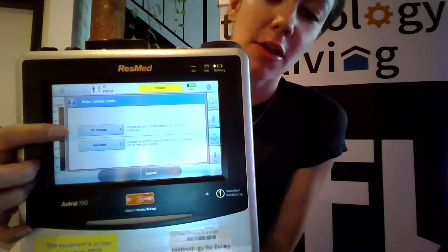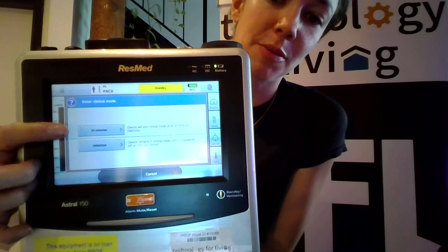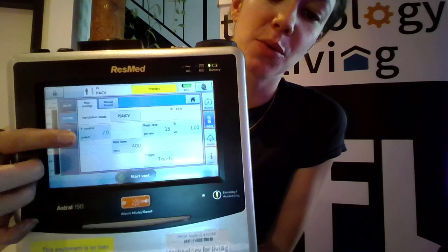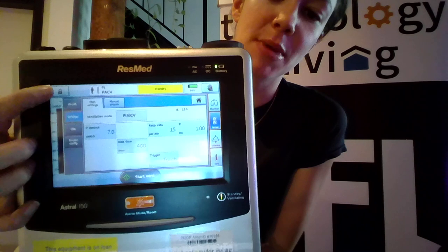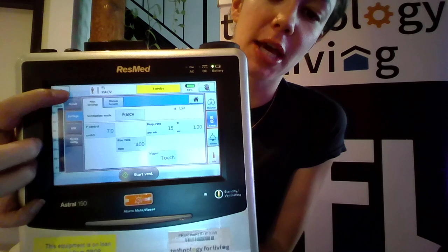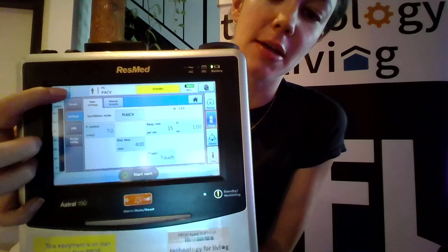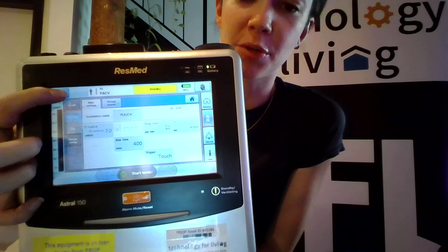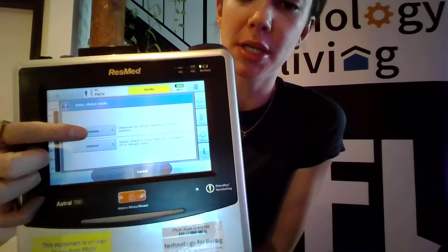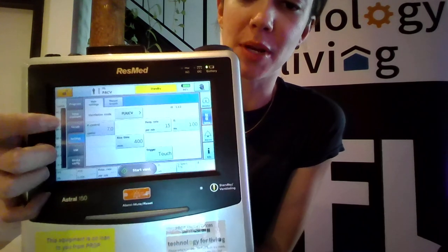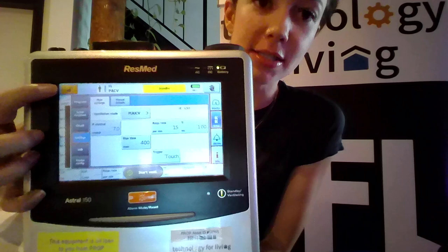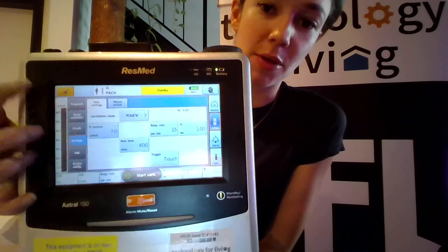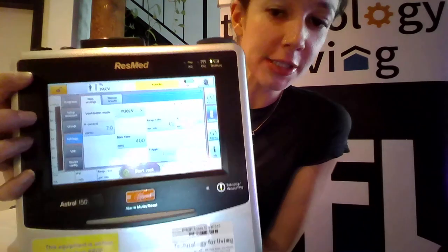We can either go into the clinical menu for 20 minutes or unlimited. We'll go into 20 minutes so that it will automatically lock again. Press and hold, click on 20 minutes — note it does kick out of the menu if you don't select anything within a matter of seconds.